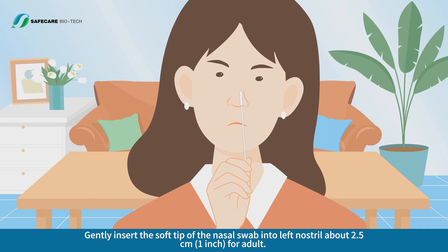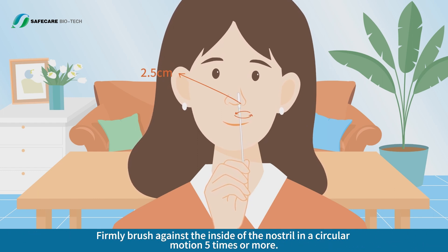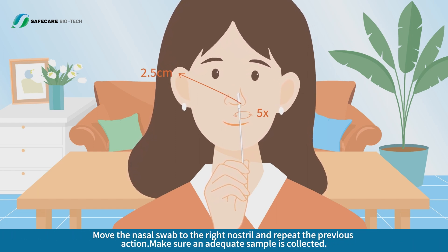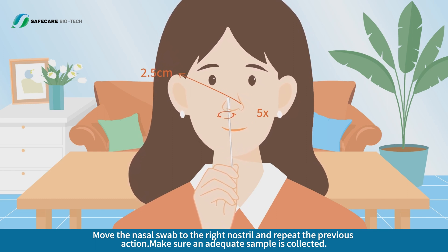Gently insert the soft tip of the nasal swab into the left nostril about 2.5 cm (1 inch) for an adult. Firmly brush against the inside of the nostril in a circular motion five times or more. Move the nasal swab to the right nostril and repeat the previous action. Make sure an adequate sample is collected.